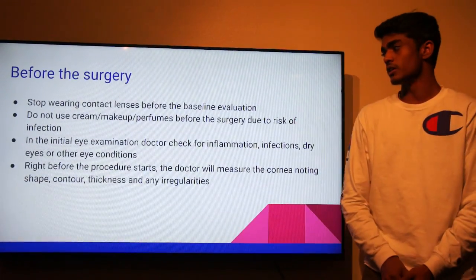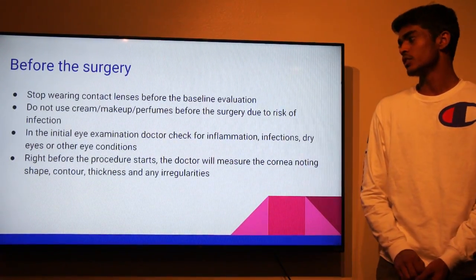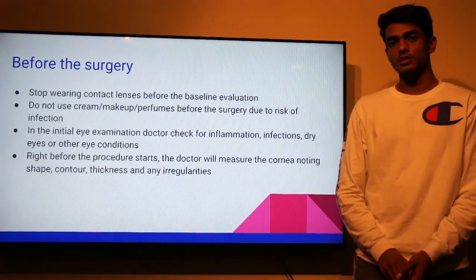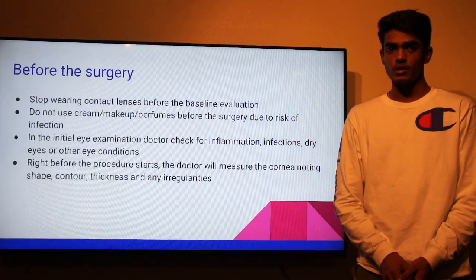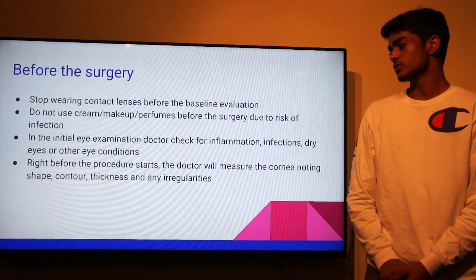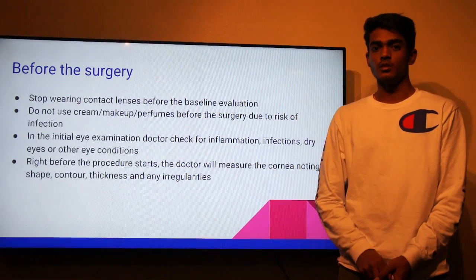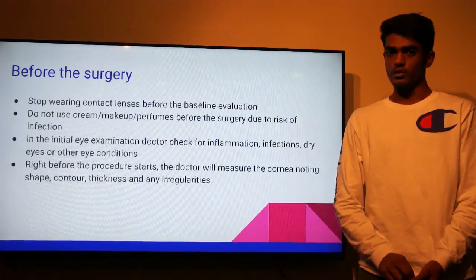During the initial eye examination, the doctor will check for inflammation, infections, dry eyes or other eye conditions that might complicate the surgical procedure. And right before the procedure starts, the doctor will measure the cornea, noting shape, contour, thickness, and any irregularities.